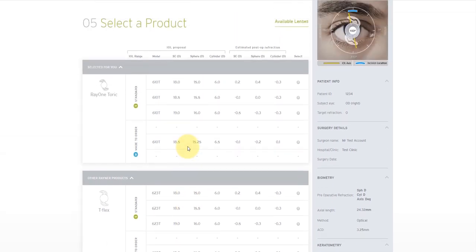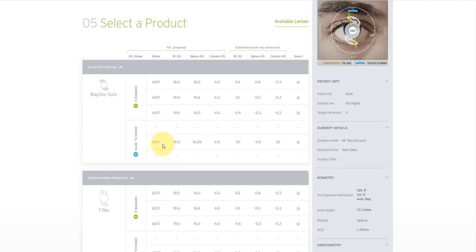If a lens is marked as standard, then it should be readily available from Rayner. Lenses marked as made to order down the side have a longer manufacturing time and incur additional cost. For more information, please contact Rayner's customer service team.